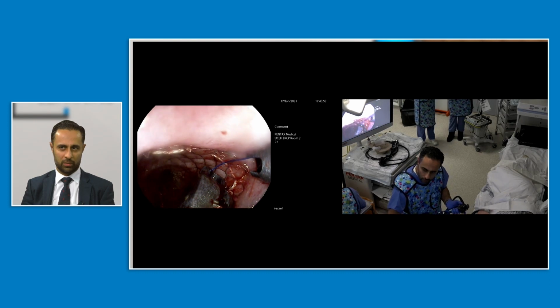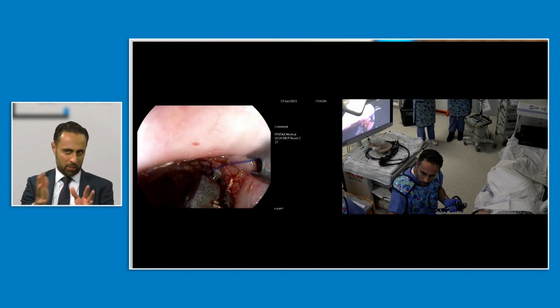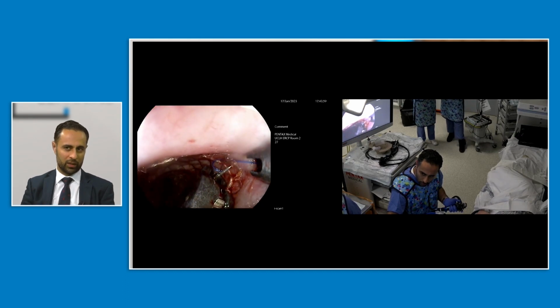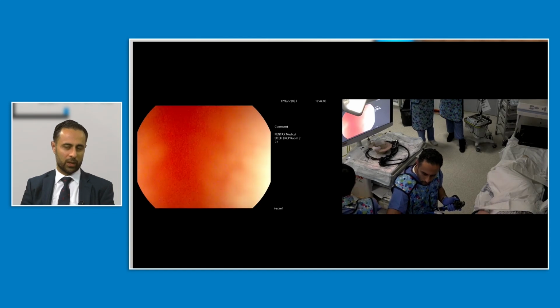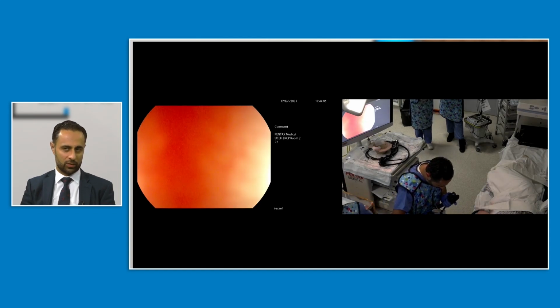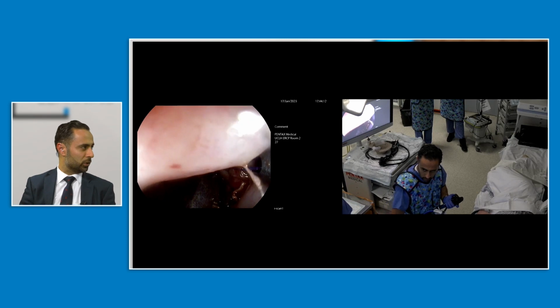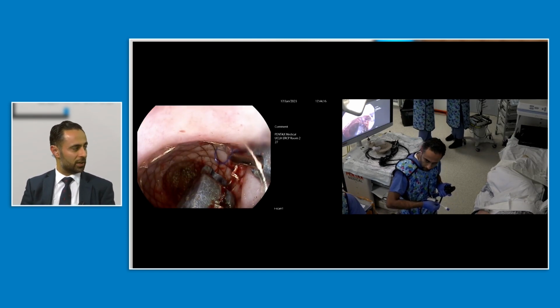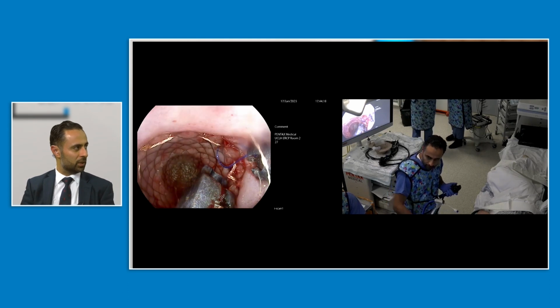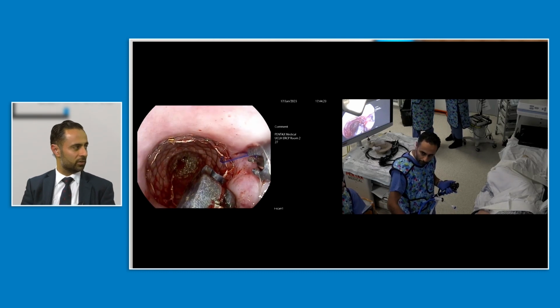So this is the patient I did earlier last week only. In my experience, when you're suturing in the esophagus with stents, I don't tend to use the helix in this case. So this is the Apollo OverStitch device here, the SX device, a single channel. In my practice, I don't know what yours is, Rayhan, I tend to put two sutures in, one on each wall, so that there's equal tension. You've done more of these than me. When do you choose to suture a stent in, for instance? What's going through your head?